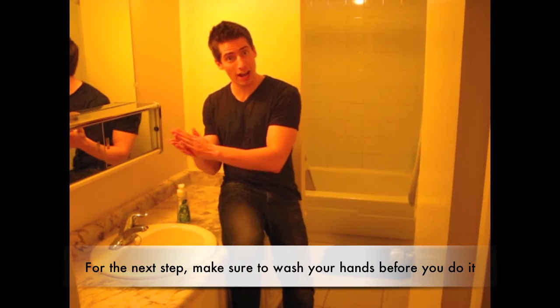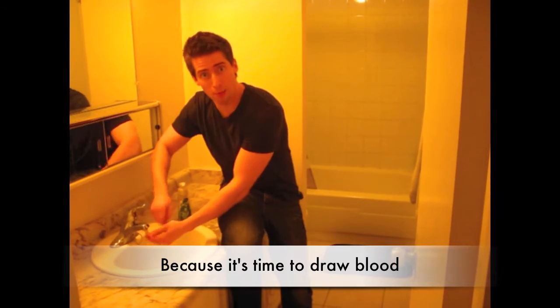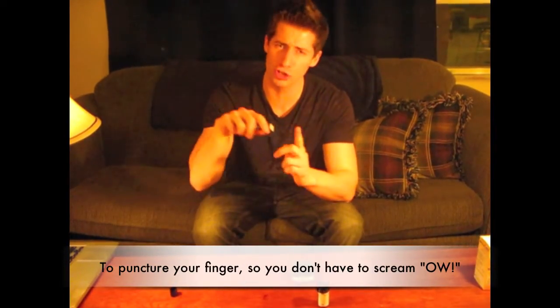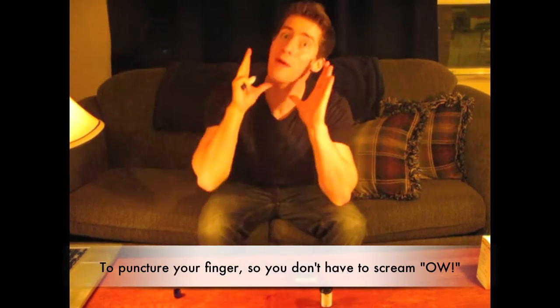The next step: make sure to wash your hands before you do it, cause it's time to draw blood. Oh man, I knew it. Do not stress too much. I will show you how to puncture your finger, so you don't have to scream out.